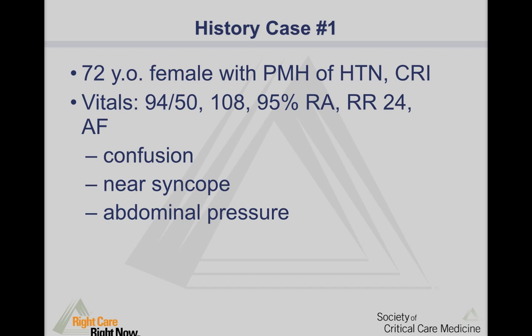This was a case of a 72-year-old female who presented acutely to the ER with confusion. She almost passed out, and she was noting some belly pain as well. Those are her vitals. She was hypotensive, tachycardic. Sats were okay. She's a bit tachypneic.